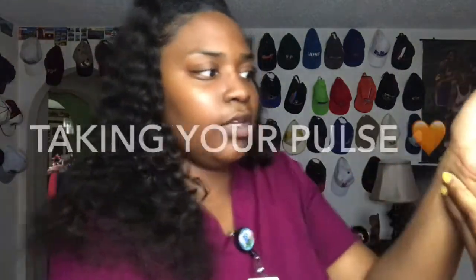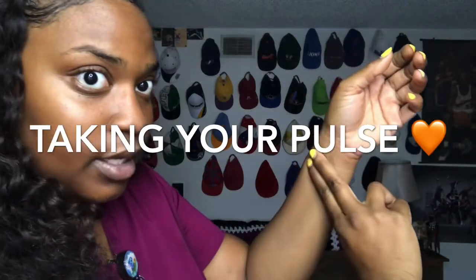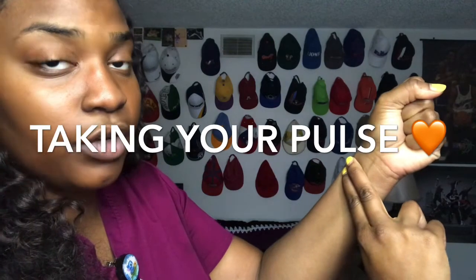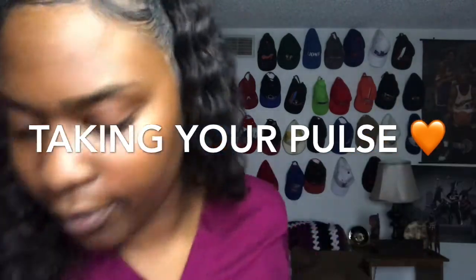Taking a pulse not only measures the heart rate, but it also measures the heart rhythm and the strength of the pulse. The normal pulse for a healthy adult would range between 60 to 100 beats per minute. Usually most people take their pulse either this way where you can feel it on this side — you just push down, create a fist, and you can feel the beat right there — or another way is right here, and some people feel it that way. So the pulse is really easy to take.